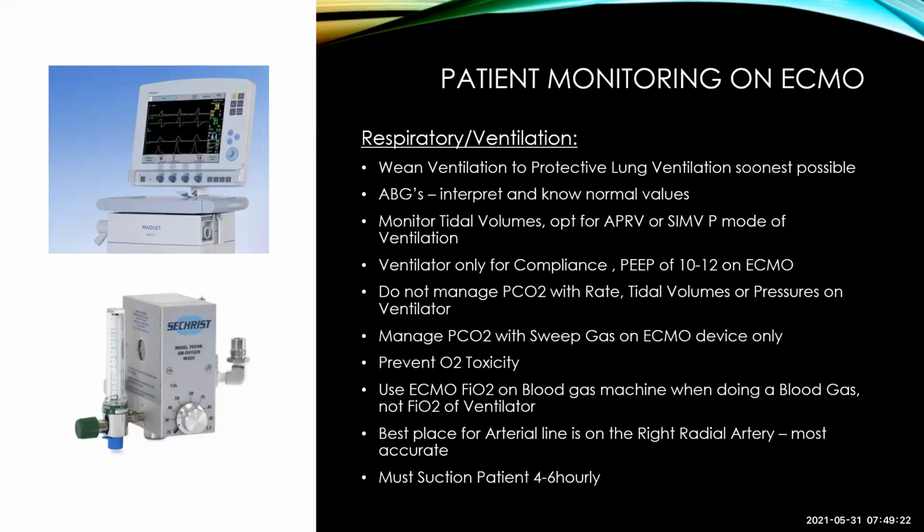Then if you're on ECMO, we do not manage the CO2 with the rate or the tidal volumes or the pressures on the ventilator anymore. We manage the CO2 with a sweep gas. So it's important that you understand the sweep gas. At the bottom here, you can see the picture of the Sechrist blender. That's what we normally use on ECMO, but you can also only use a flow meter.